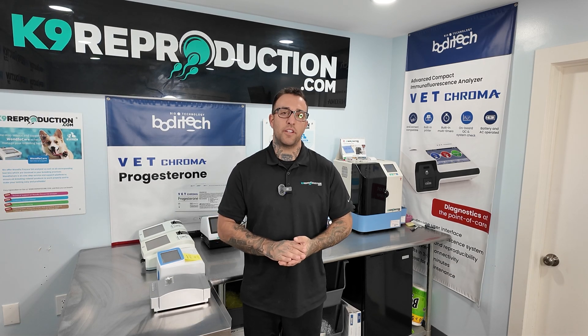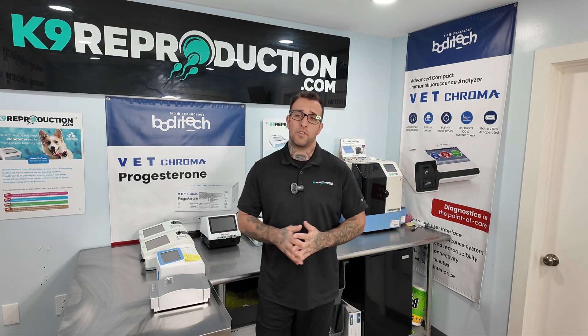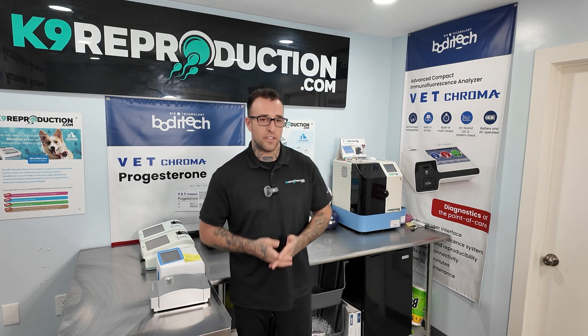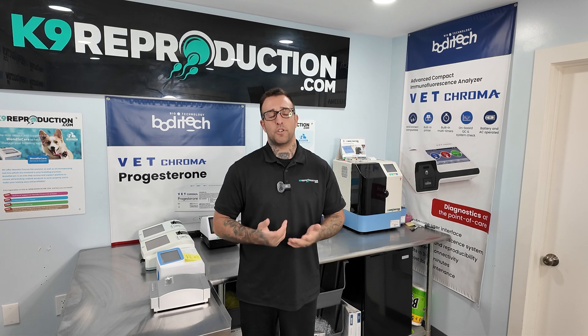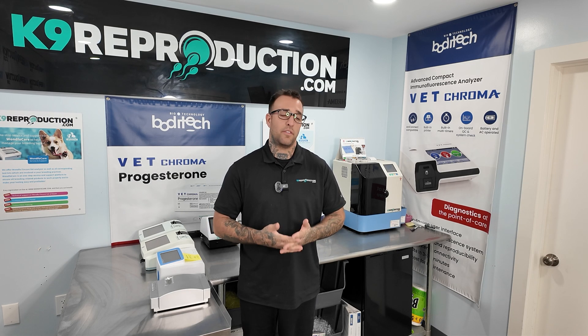When you dive into canine progesterone testing it's almost impossible not to hear the words IDEXX. Unfortunately, IDEXX machines you can only purchase with a vet's license, so that basically removes them from the list of purchasable options for normal dog breeders or anyone looking to do anything without a vet's license.